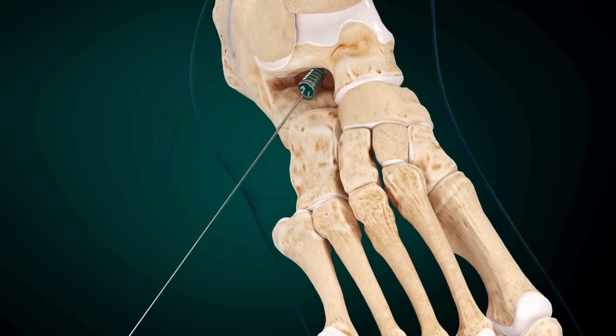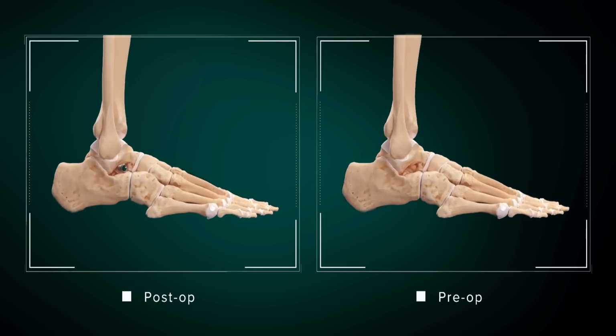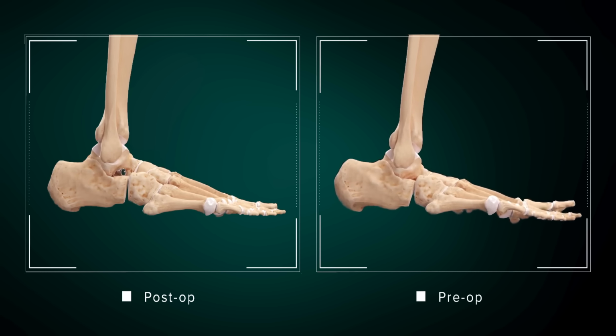The K-wire is removed. An eversion of the foot may support the removal of the K-wire as the medial narrow part of the tarsal canal opens in eversion. The final placement is checked with fluoroscopy. During bodyweight load to the foot, the Prostop subtalar arthroereisis implant prevents the eversion of the calcaneus and anterior translation and plantar flexion drop of the talus.